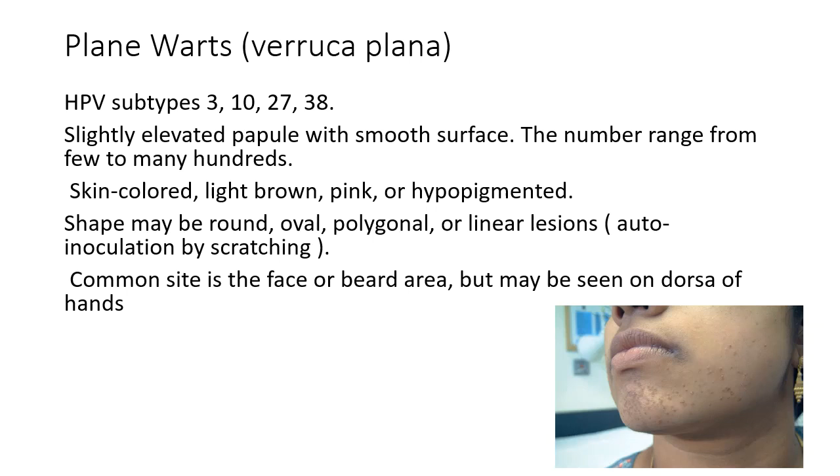The histologic features of verruca plana are slightly different from verruca vulgaris. There is acanthosis and hyperkeratosis, but no papillomatosis or parakeratosis is usually seen in verruca plana. Vacuolization of cells of the upper stratum spinosum and stratum granulosum with margination of keratohyalin granules, which is also seen in verruca vulgaris. Often they have some dyskeratotic keratinocytes.